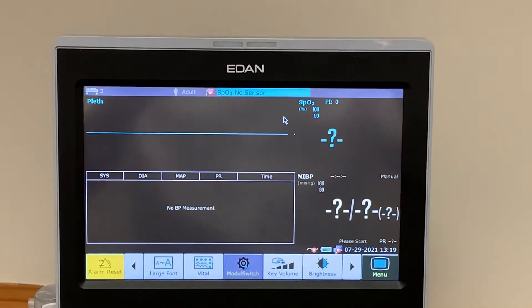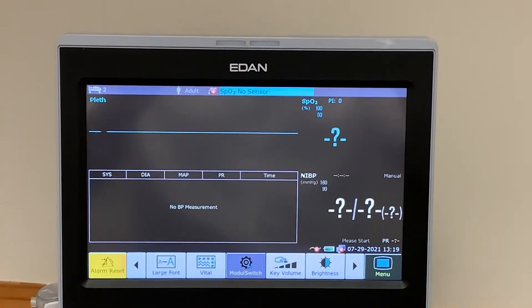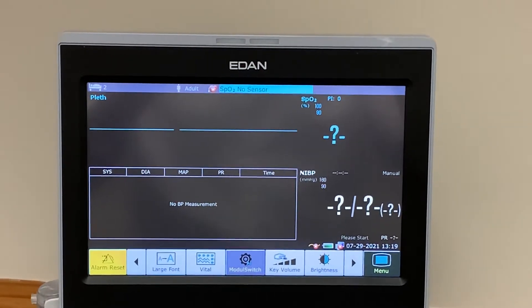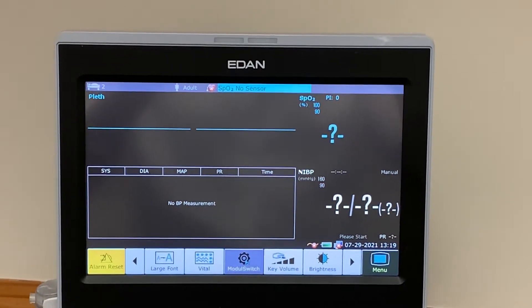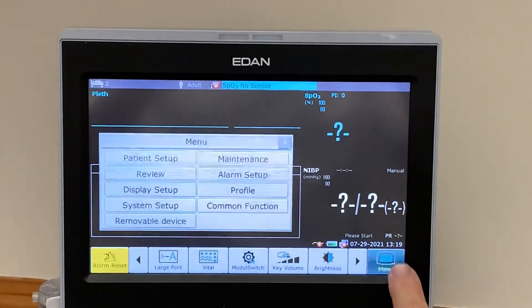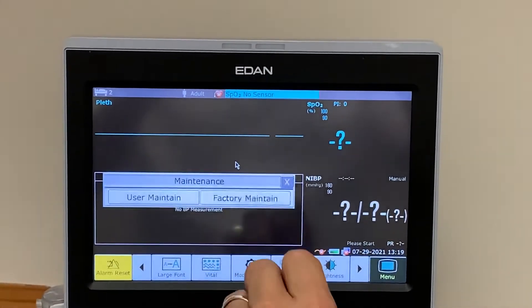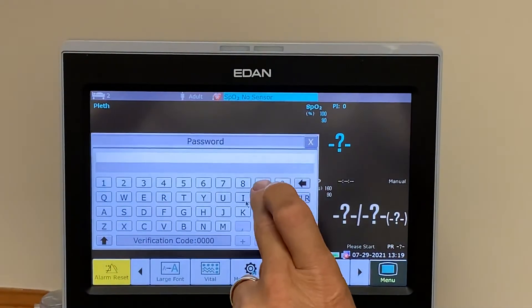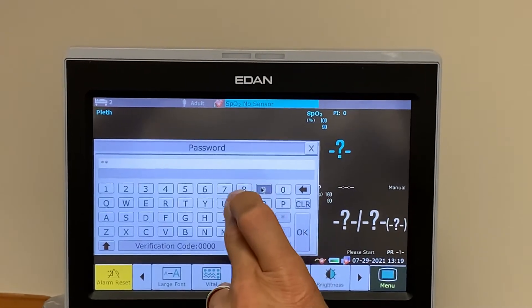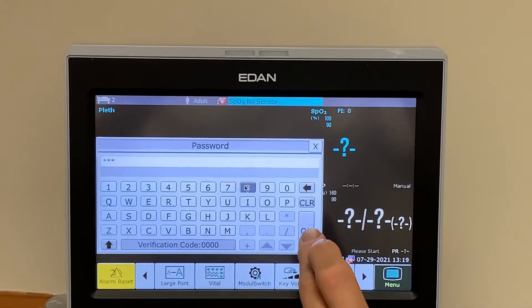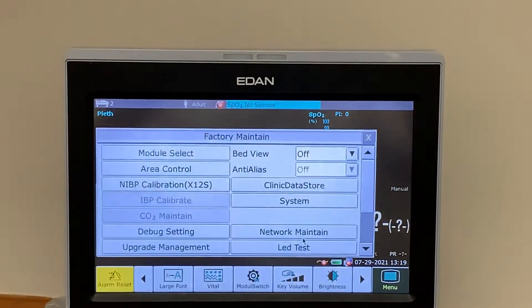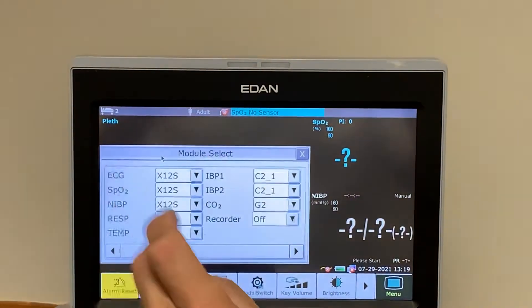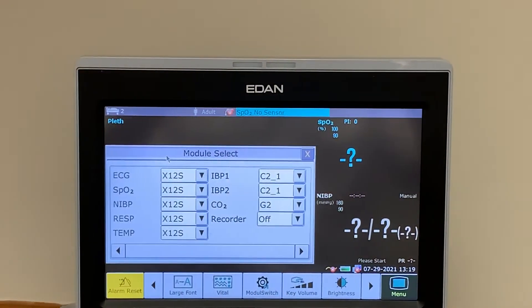The more permanent way to remove parameters disables the ability of clinicians to re-establish them without a password. To do this, go into Menu, then Maintenance, Maintenance again, then Factory Maintain with a password of 998 and press OK. Then go to Module Switch, where you can now see all those parameters.